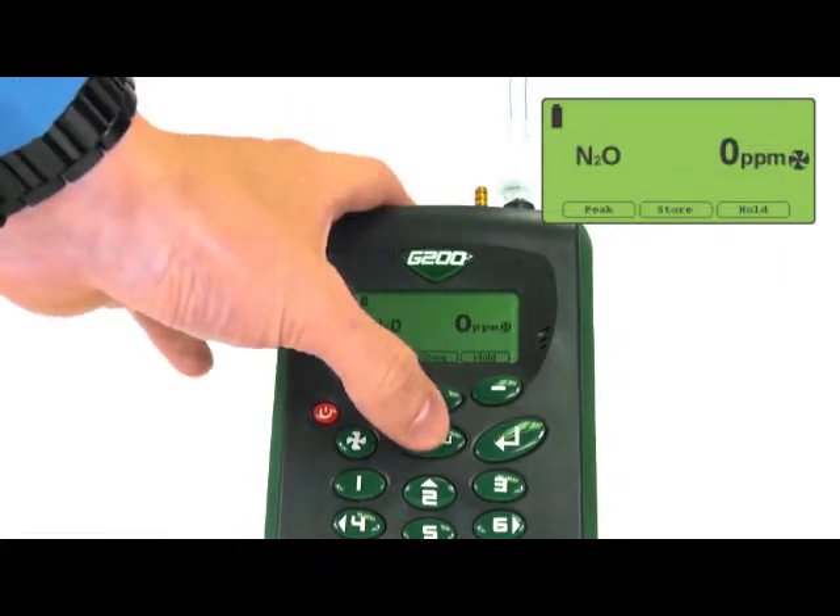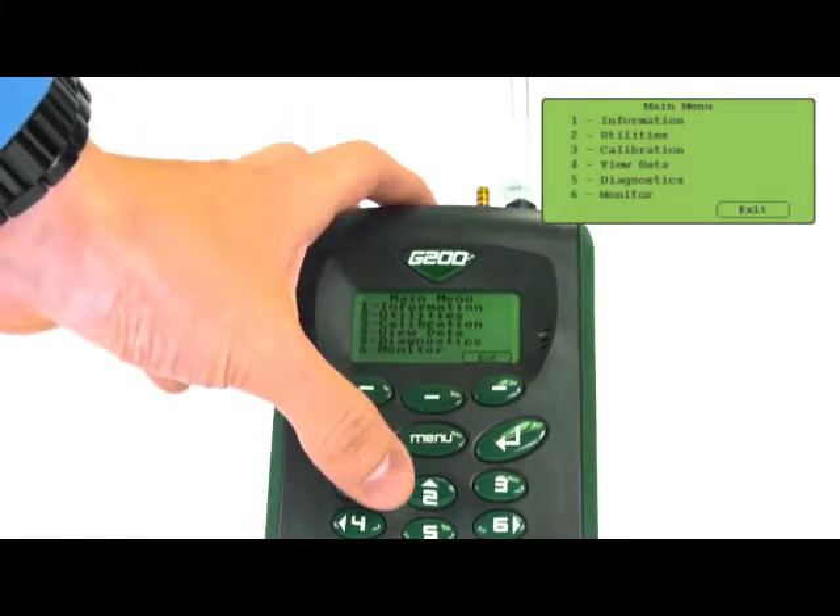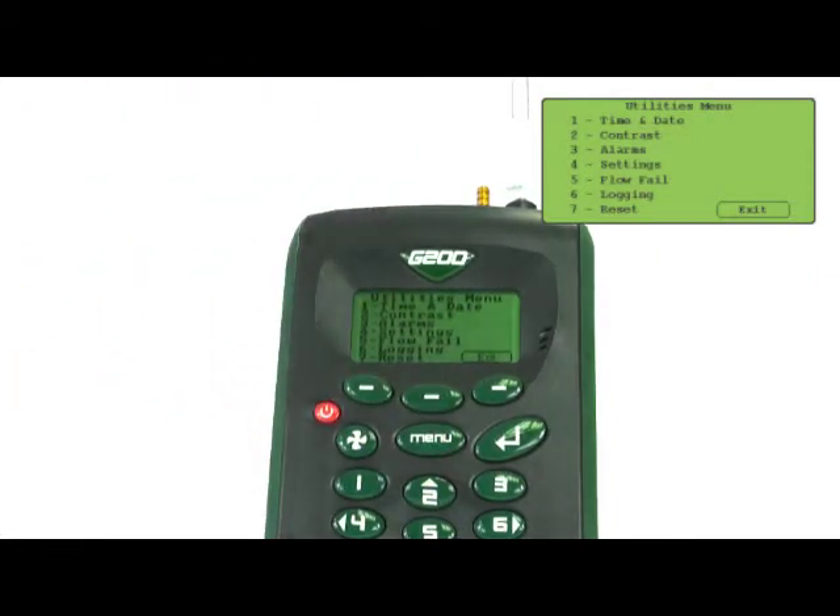The utilities menu allows the user to change the time and date, set the contrast, set the N2O alarm levels for the dormant monitoring mode, flow fail settings, and logging options.